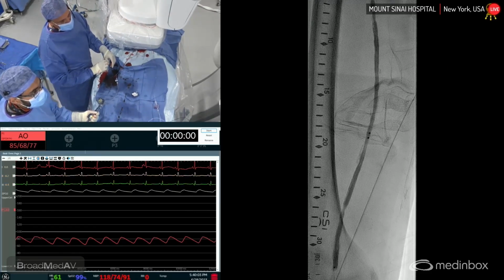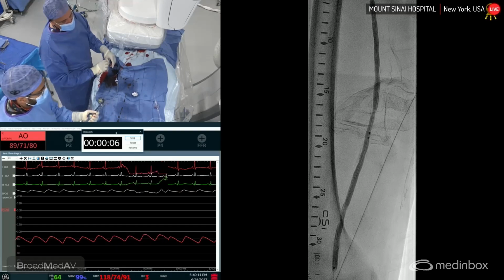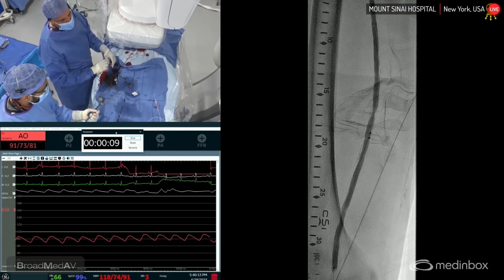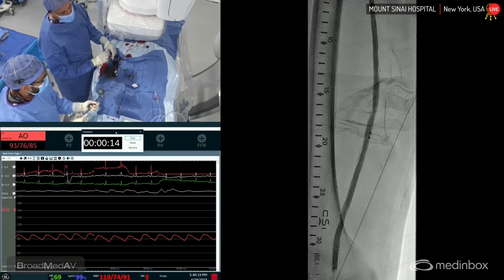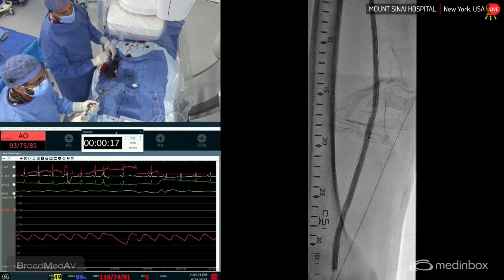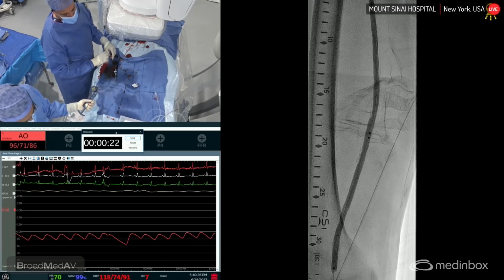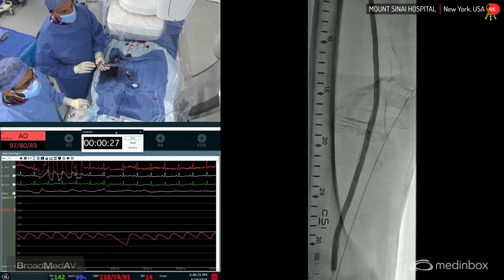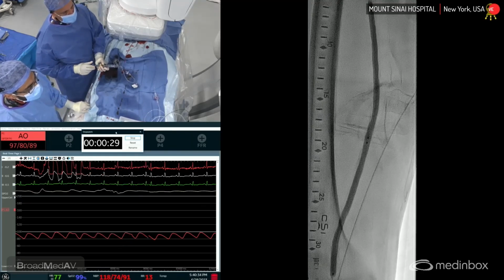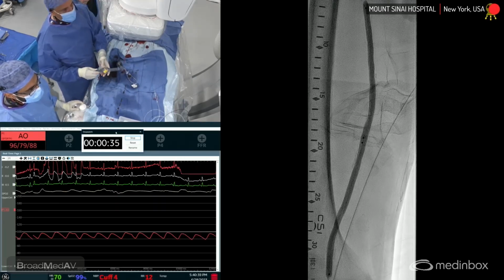So vessel prep with balloon in DCB balloon angioplasty was done in Europe, was not done in the American IDE. Yes, just breathe it out. Breathe it out for us. So it's going to hurt a little bit as we're opening it. Keep opening. So we just keep going up to nominal, is what? 5. 6. Okay. Not quite 6. Okay. And that's your 6 atmospheres right there. There you go.